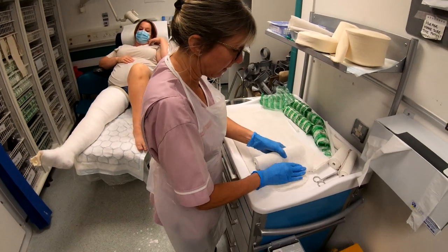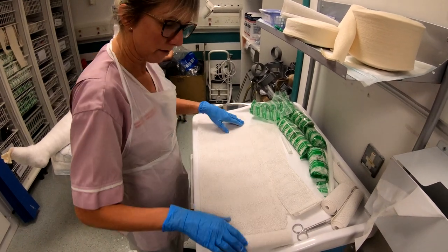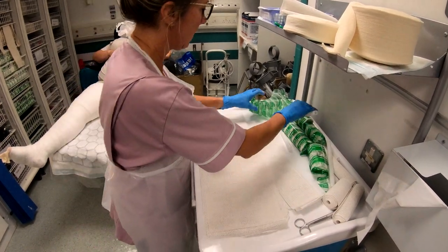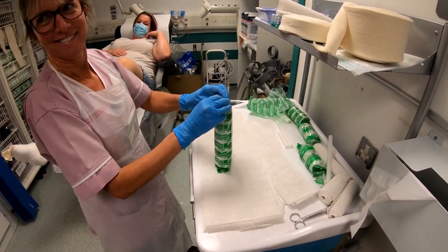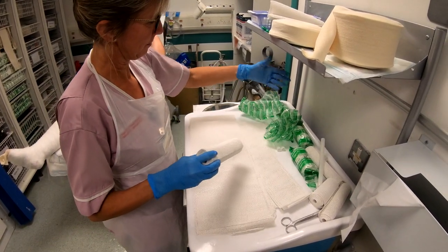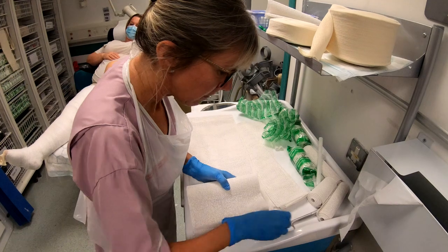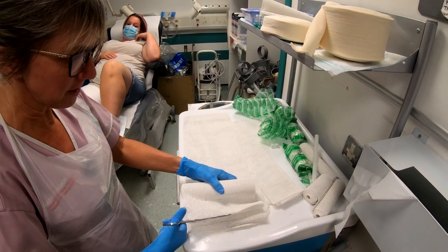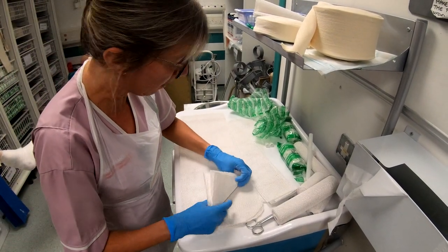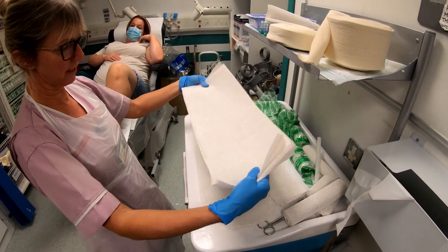So we can measure that out for another six layers for the main slab for the above knee. It might feel like you're doing many pieces here, but it's the same process. That's why the person who's cutting the plaster needs to be the one in charge when they're applying it. So that's the main slab — you don't need to cut it in any shape or form, it is just as it is.